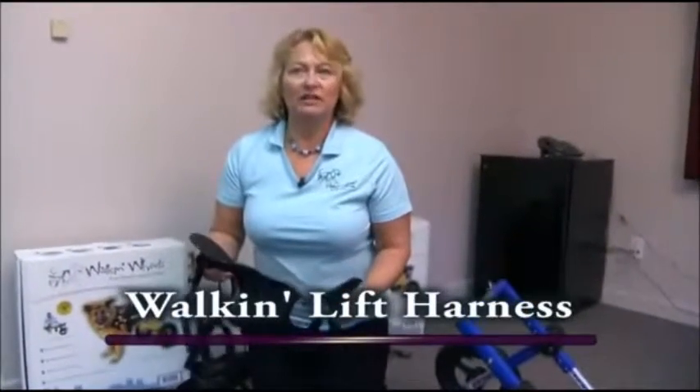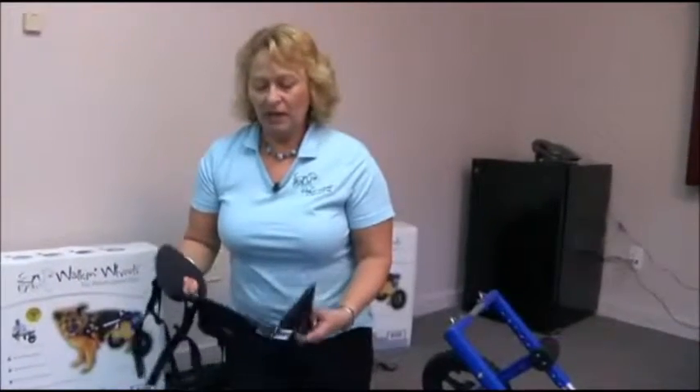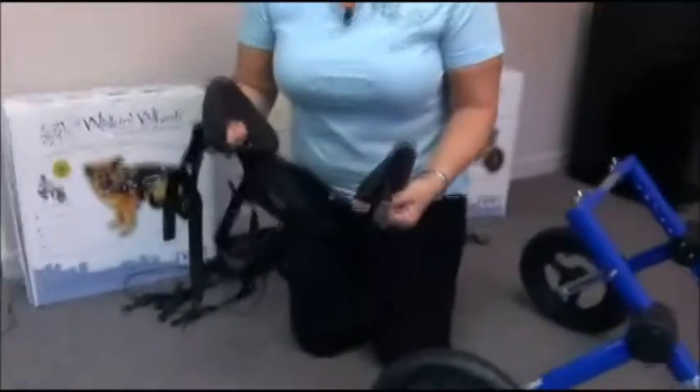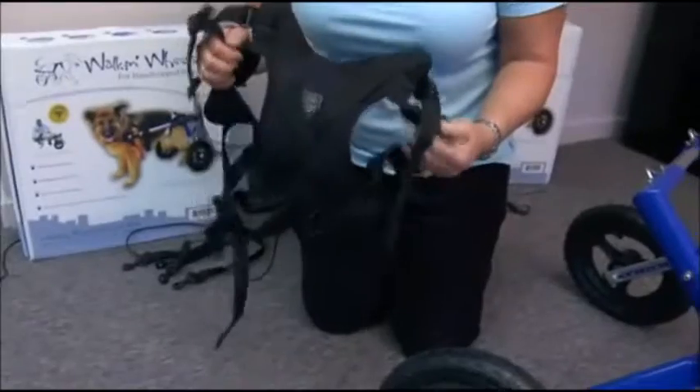This is the compatible walk and lift harness that is compatible with the wheelchair. This is an optional item — it does not come with the cart and usually sells anywhere from $40 to $70.